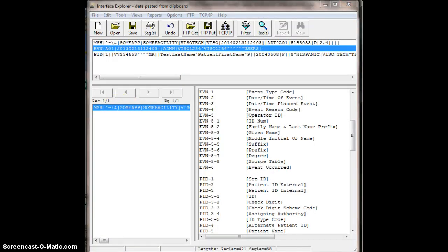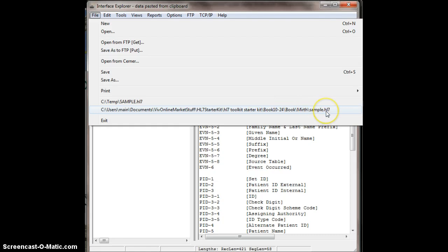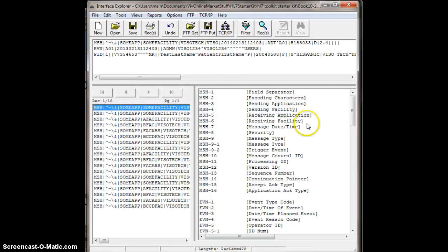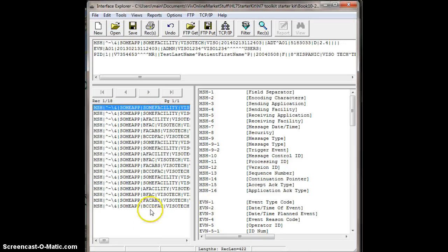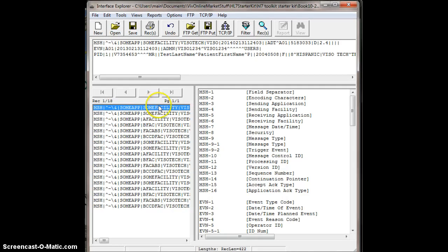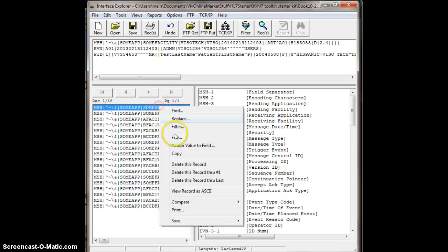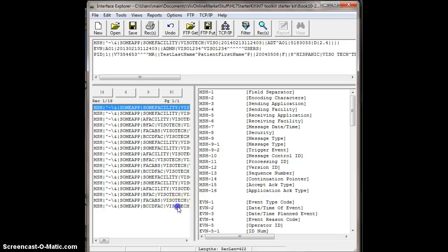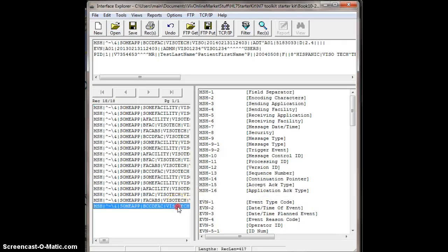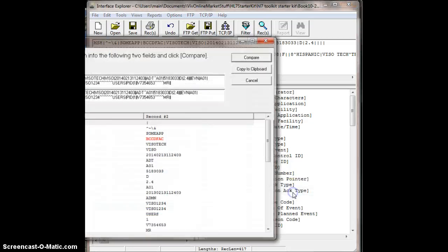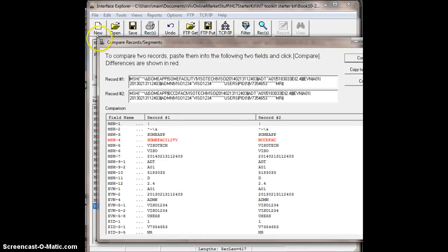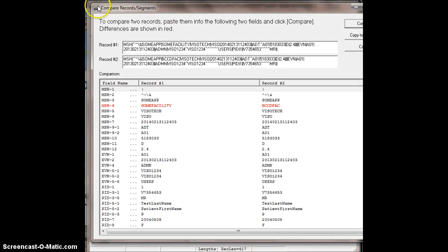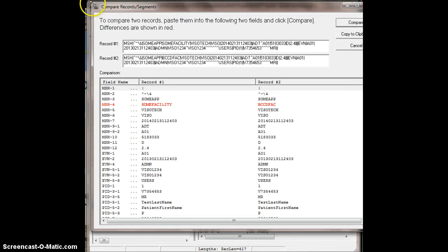You can compare files and get a difference report. That's pretty cool. Let's try that. Let's go open up our sample.hl7 file from the recent document list. I can compare files and get a difference report. Let's say I want to compare the first message to the last message. I'm going to right-click, go to compare, and set this one as record number one. I'm going to go to the last one, same thing, right-click, compare, set this record as number two, and here we go. Look at this, how awesome this is. This is a diff inside of Interface Explorer.